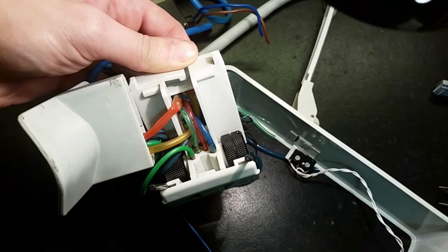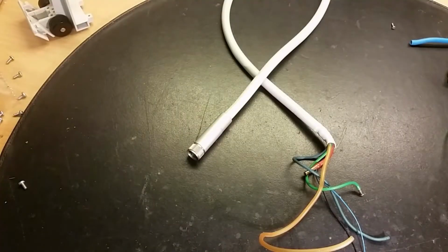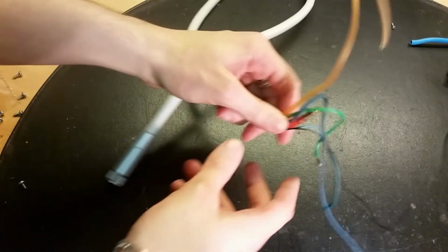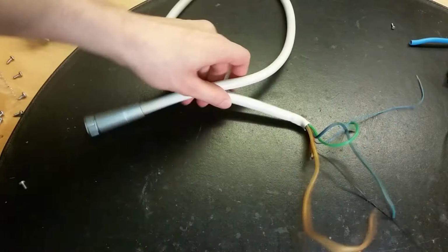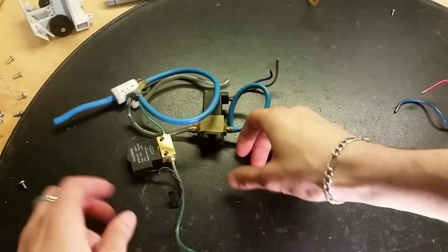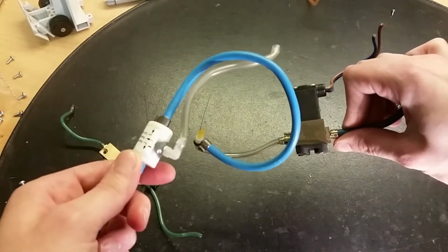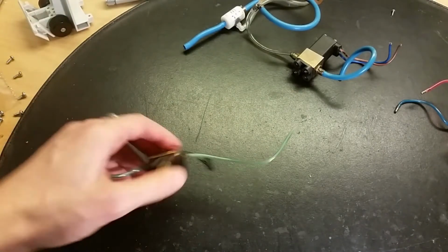Yes, you can see a little better look at these controllers. They're like potentiometers, but for fluids. So here we've got the connector cable. It looks like this in there. And yes, these are 4 tubes and 2 wires. You can see on the valves here, these are joined together. This was the air valves for a slow flow air. This was a high pressure air. If there's any air remaining there, this is for controlling the pressure, maybe. This was for the water.